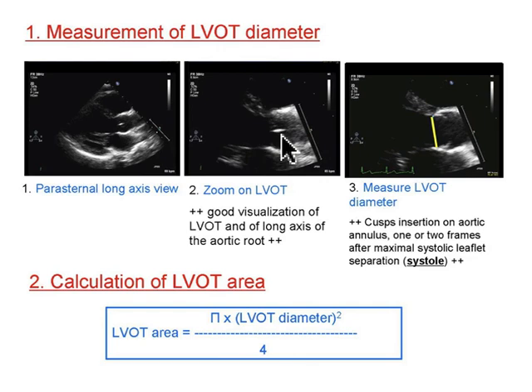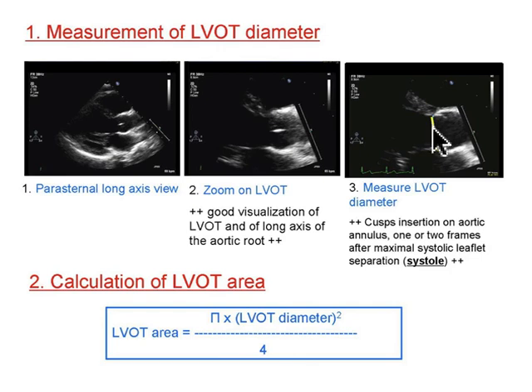In that frozen state, you take the dial — the bottom left-hand button — and rotate it counterclockwise. You'll back up to where end-systole was, and you'll watch those valve leaflets march right open. Once they're open at their maximal point, you can take a measurement using the calculations functions between those two leaflets, and that's your LVOT diameter — your left ventricular outflow tract diameter.